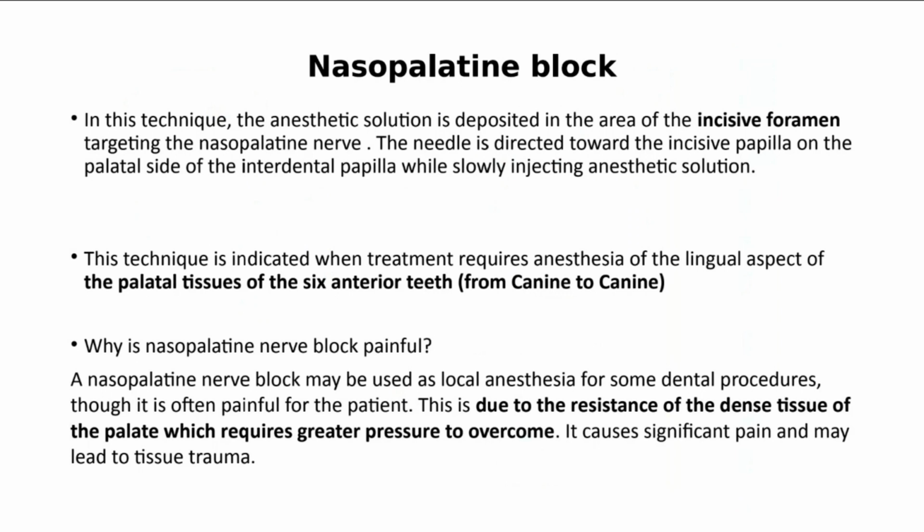The problem with the nasopalatine block is that if you're working canine to canine, you have to do it anyway. But it's painful. Why is it painful? Because outside soft tissues are softer. The inside, the palatal side, the soft tissues of the palate, are harder. Okay, it's dense. The tissues there are more dense, so you need to put more pressure to get in. And generally speaking, the palate is sensitive.